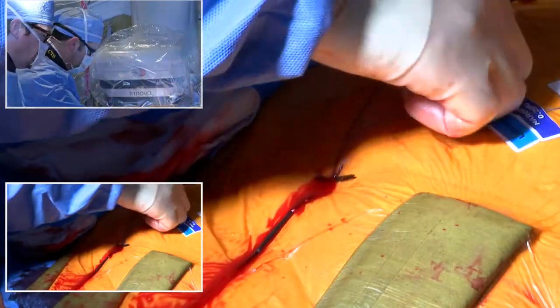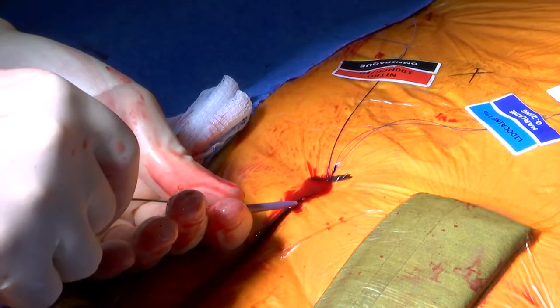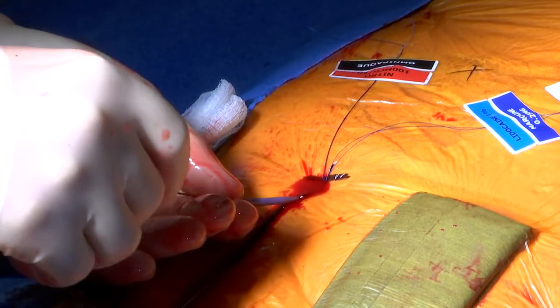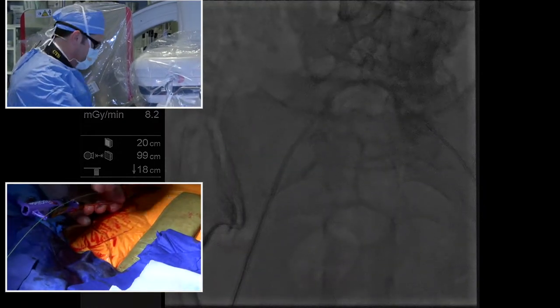We're going to need the Amplatz wire. Yeah, thanks. Okay. Now we're going to put a stiffer wire through here. And this is the wire that we're going to use to actually get the valve delivery sheath through. All right. Let's see if I can. Oh, sometimes this gets stuck in the Perclose. Let go for a second. Yeah. See, sometimes the Amplatz wire won't go directly through the Perclose because of the hemostatic valve.